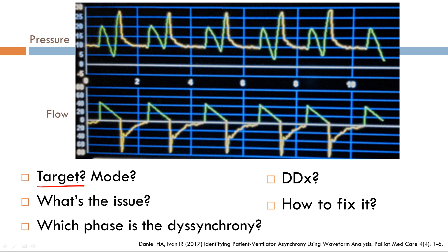So what's the target variable? Taking a look at my flow scalar, I can see that it looks like a decelerated ramp. That's something the operator has set. So therefore, I can say that flow is my target variable. As a result, this mode of ventilation is volume control ventilation.